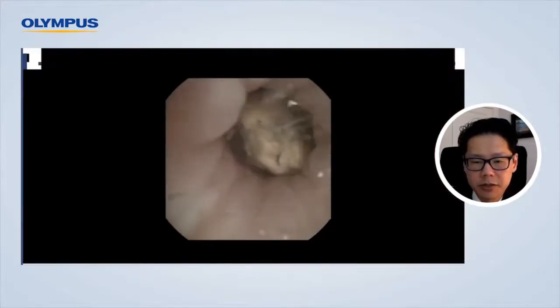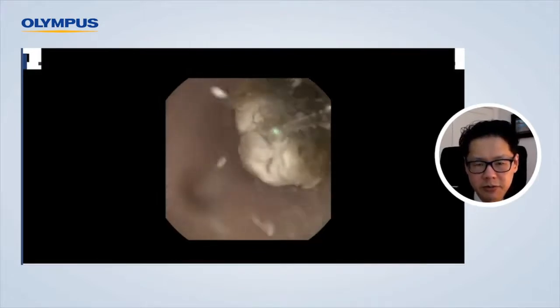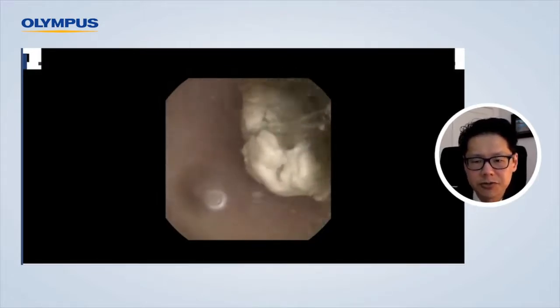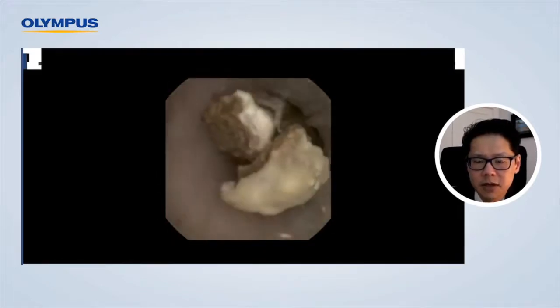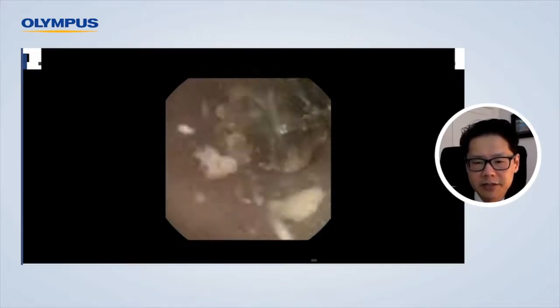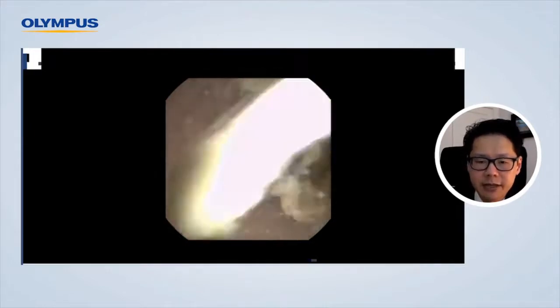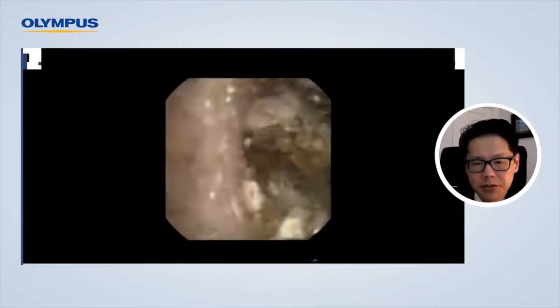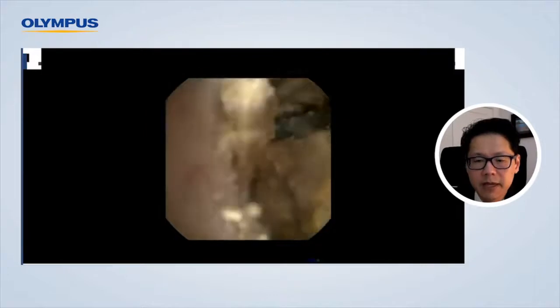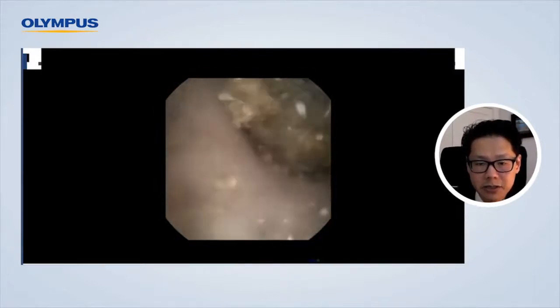Now, here's a stone in the proximal ureter, and one of the things I really like about this, as I talked about earlier, was the lack of retropulsion using this laser. The stone doesn't fly up very much, and it really just wants to dust very, very well. I have found this to be very efficient at dusting, and I, for instance, had a 2-centimeter stone in a patient who could not undergo PCNL, and I booked the room for about 2.5 hours, because that's how long it's normally taken me for such large stones.